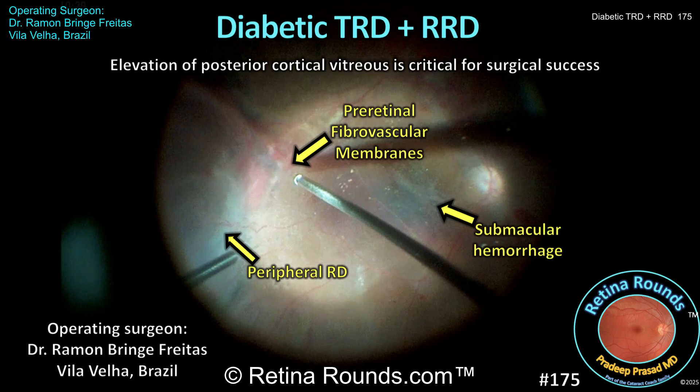Retina Rounds, episode number 175: Diabetic Tractional and Regmatogenous Retinal Detachment. Posterior hyaloid elevation is a critical step when performing vitrectomy for a regmatogenous retinal detachment. In diabetic patients, this step can be challenging due to the presence of vitreous schesis, tight vitreo-retinal adhesions, and the lack of countertraction when elevating membranes and vitreous from detached retina. Our guest surgeon is Dr. Ramon Bringhe Freitas, a vitreo-retinal specialist at Evangelico Vila Velia Hospital in Brazil. His patient is a 42-year-old phacic diabetic male with mild tractional membranes who now presents with a macula-involving regmatogenous retinal detachment. Let's check out the surgical approach, and thank you, Dr. Bringhe Freitas, for sharing this case.